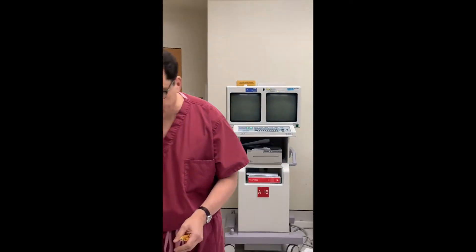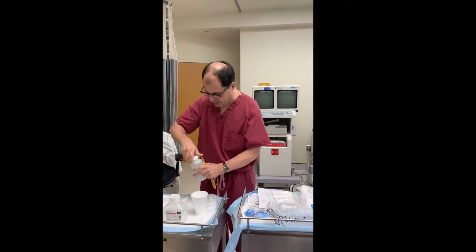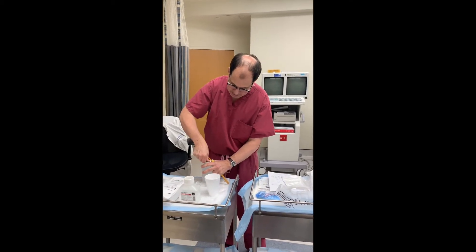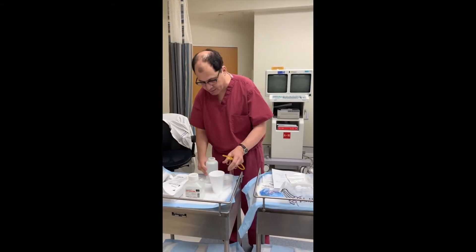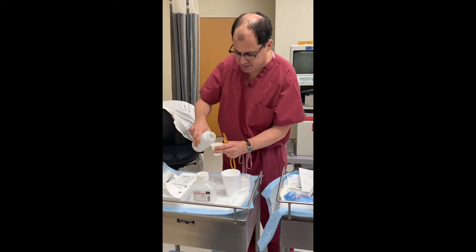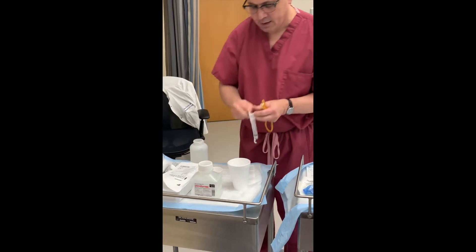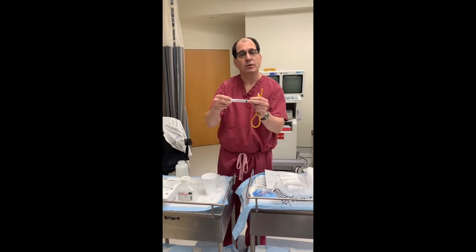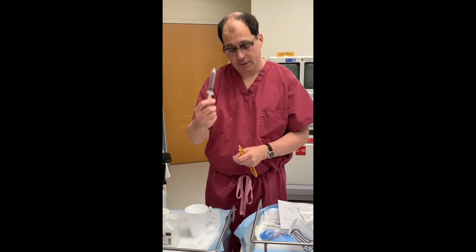You take some water — it can be water or saline, but I'll explain that later. You find a clean cup; it doesn't have to be sterile. Then you take a syringe — usually a 10 or 12 cc syringe — and draw up the fluid.